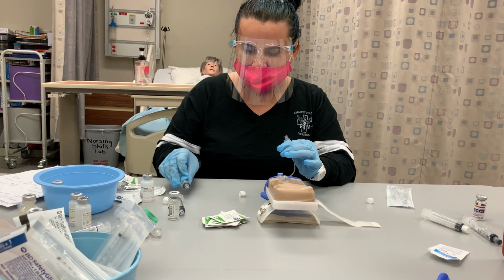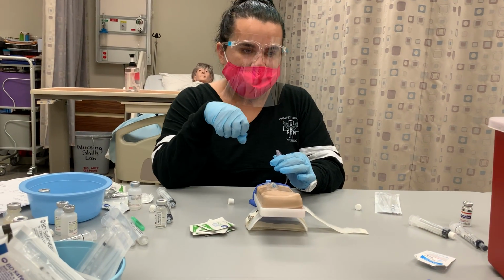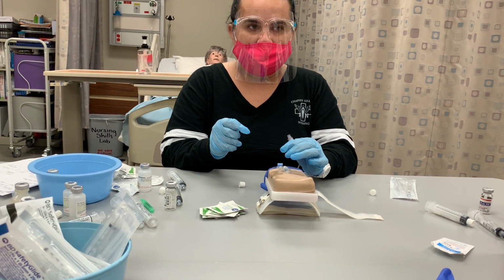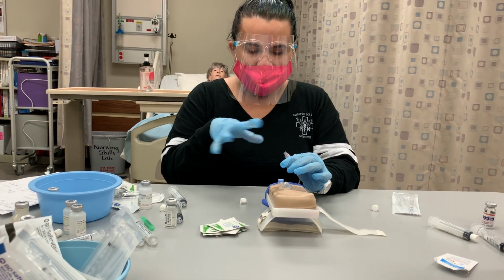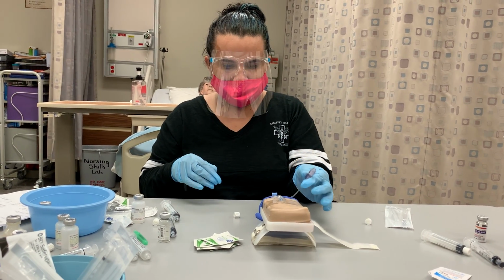We would have discarded this, and then we would attach the green sterile port, to make sure that no bacteria gets inside of our clean port.